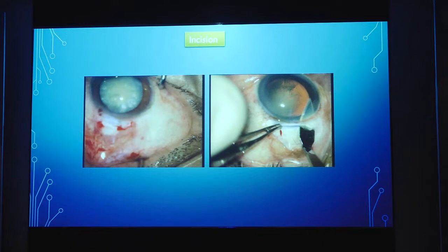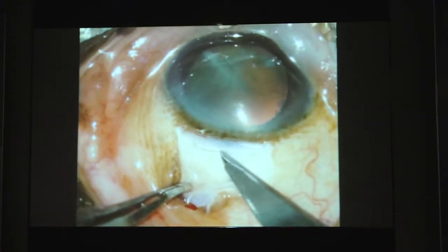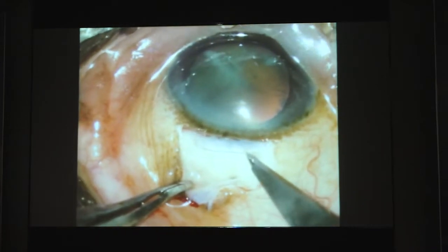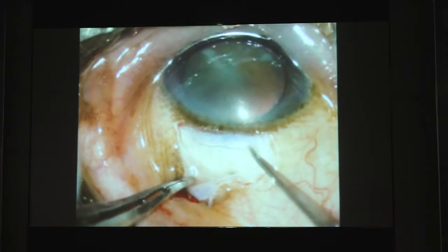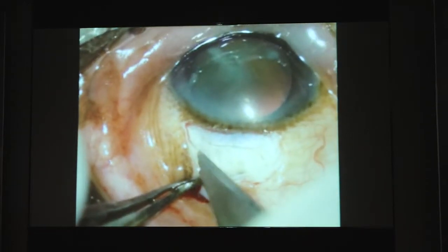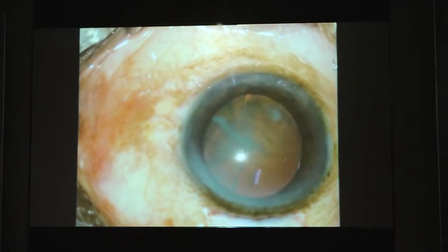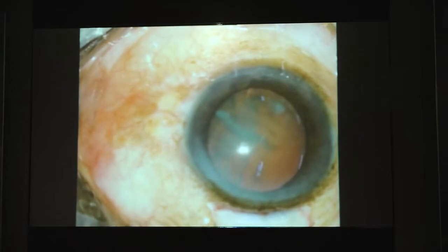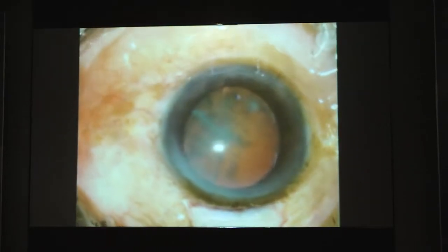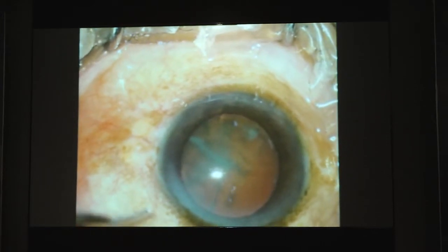And making the incision. So this is the incision. Here are some more videos about the incision, because what is different in phaco and SICS is the incision itself. So it is extremely necessary to do this properly. As you can see very clearly over here, it's a modified frown incision. The video is enlarged so that it can be seen very clearly.